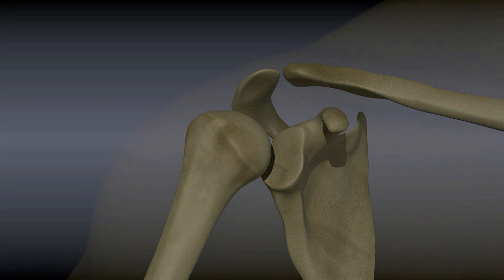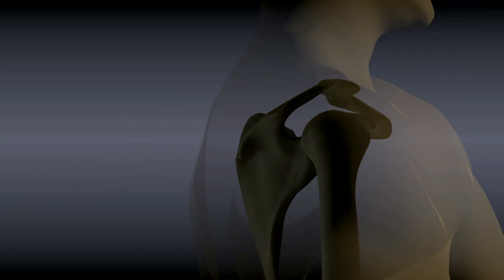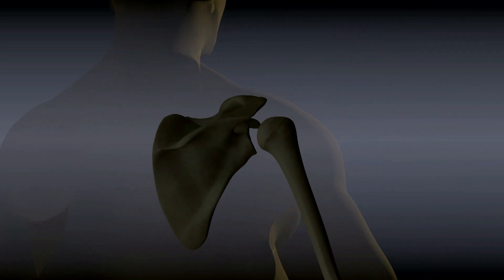This is where the rotator cuff usually becomes inflamed or torn. Injecting a corticosteroid, often called cortisone, into this space can reduce inflammation and relieve shoulder pain. It can also help to confirm that shoulder pain is coming from the rotator cuff.